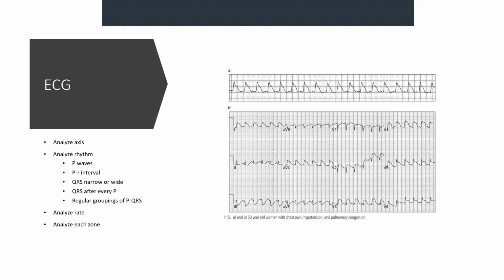We haven't had an ECG presentation for a little while, and I decided this might be a good one for us to have a look at. It's quite an interesting one, not a particularly advanced one, but one that makes you think a little bit. So I hope you had a chance to have a look at the ECG and maybe came up with your own ideas of what was going on. So let's jump into it.